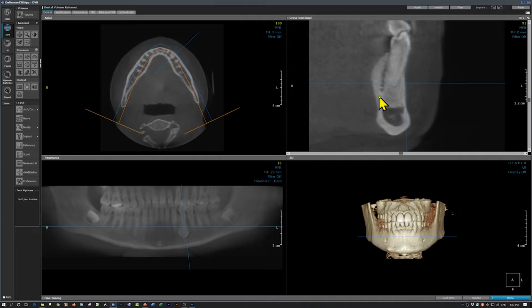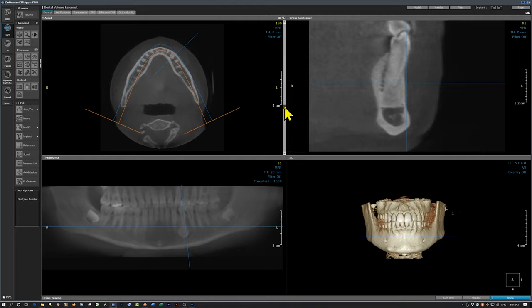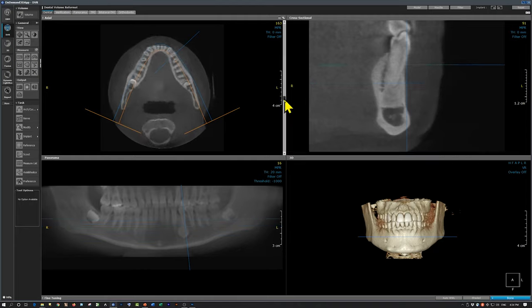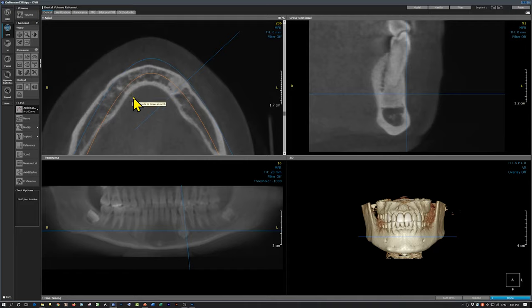You can still see the apical PDL space intact. The radiopacity is almost homogeneous with slightly lesser density at the center, giving what appears to be a ground glass appearance. There is no expansion of the cortical plates and no perforation. On the axial slices we see similar findings. There is no expansion of the cortical plates — neither the buccal nor the lingual — compared to the other side.